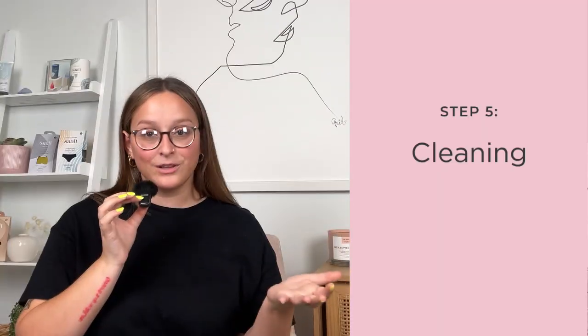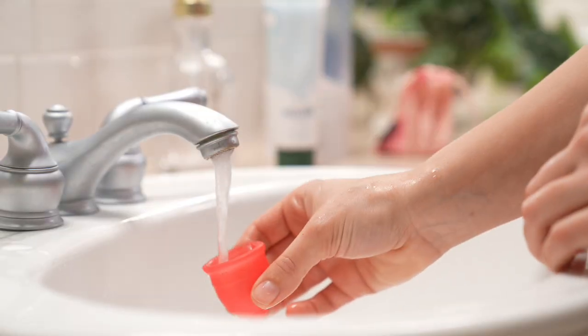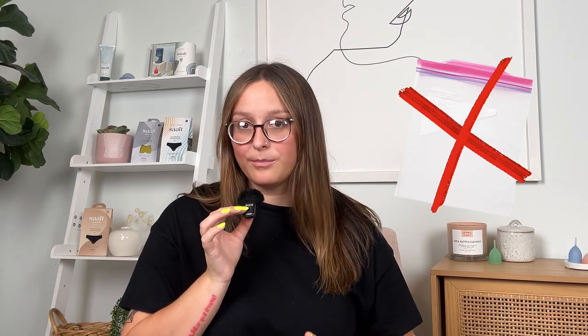Now let's talk cleaning. For during your cycle, you can rinse your cup with cold water to prevent staining, and then wash with warm water and a mild fragrance-free soap. Then you can reinsert. After your cycle, you're going to want to boil your cup. Then allow it to air out and dry completely. Lastly, you'll want to store it in its breathable cotton bag until your next period. Never store it in an airtight bag or a plastic baggie.